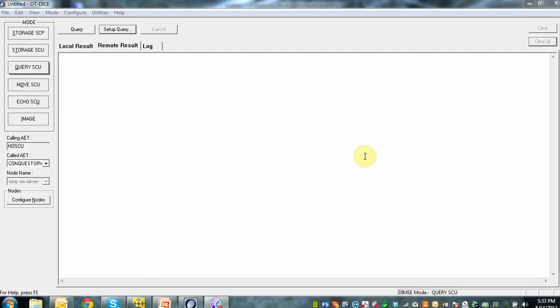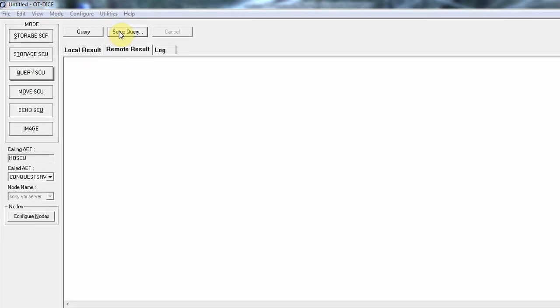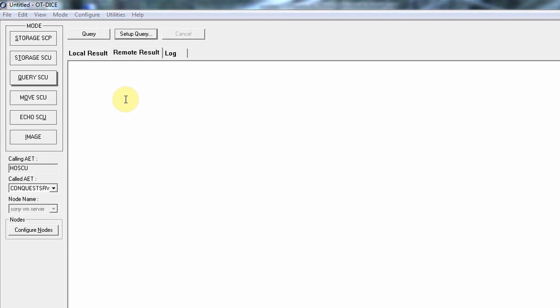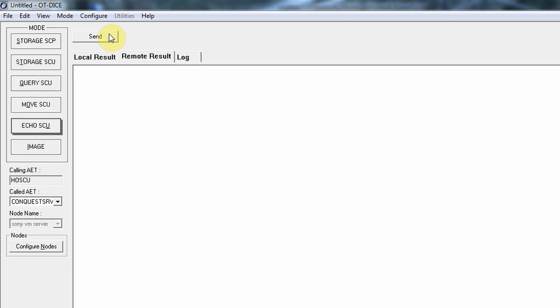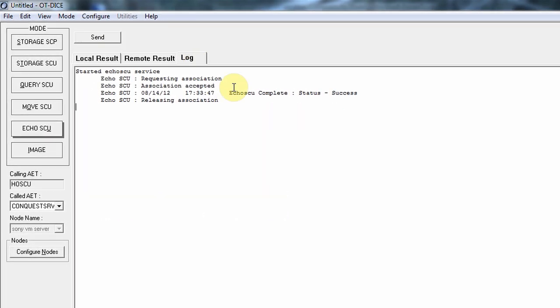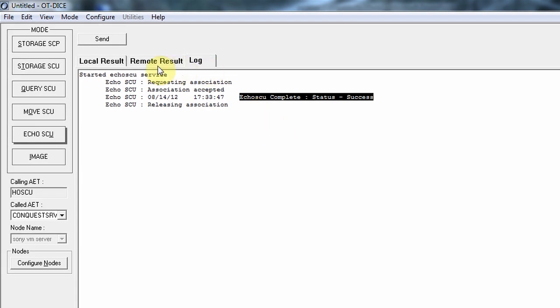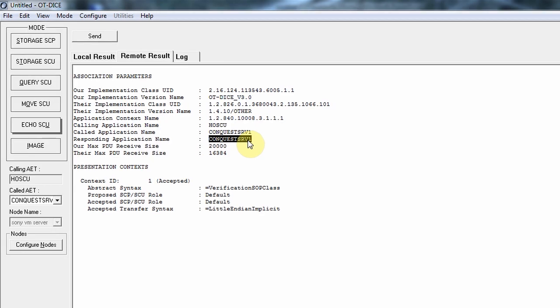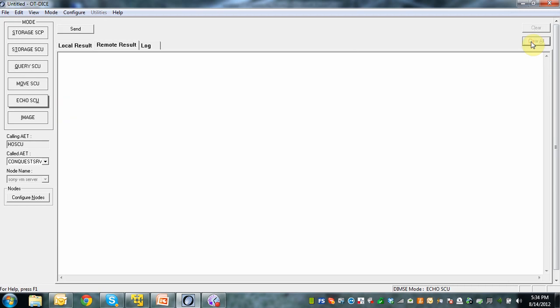Looking at the OT-DICE modality simulator, we see that there's a Query SCU button and we have a setup query. But before we do any communication from the modality simulator to our modality worklist provider, you always want to do an echo first. I do an echo, I do a send, and the status shows success. I can successfully talk with my modality simulator and in the remote result I can see Conquest — this is my AE title for my simulator modality provider. Now I'm going to do my query.